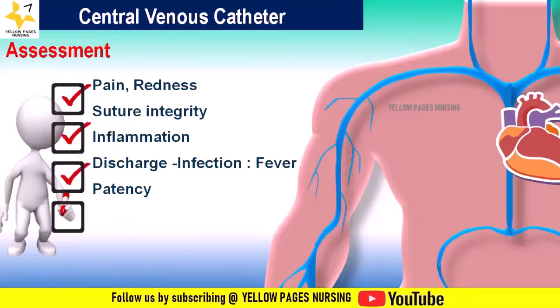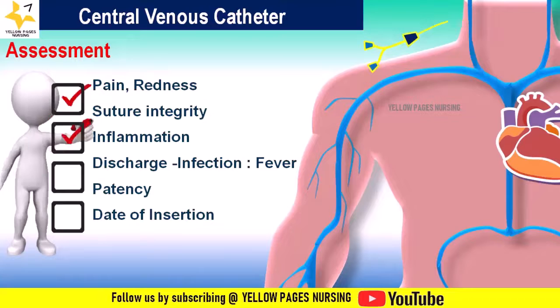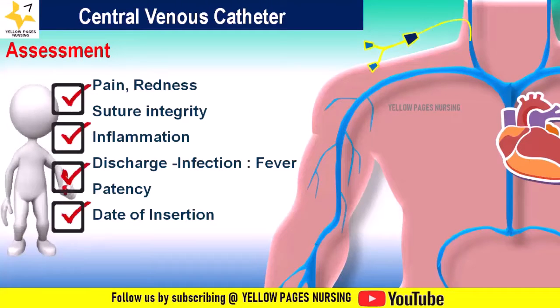Next is assessment of date of insertion. Recording the date of insertion of the central venous catheter is important for patient care and safety. And every institution has its own policy for either change or removal of central venous catheter.